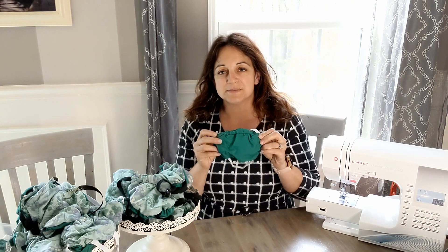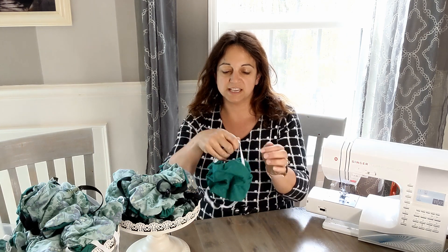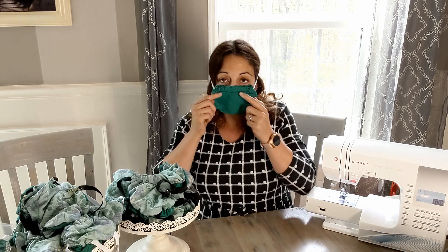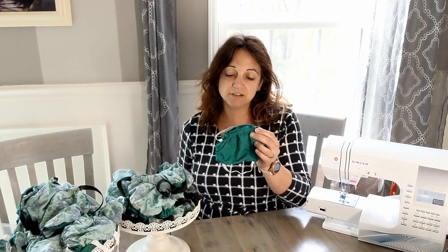So I started making this mask, which is a pocket mask that has elastic on all four sides on the inside — you can't see it. And when I'm wearing this mask and blow up, no air goes to my eyes. The pocket inside this mask is a rectangle.